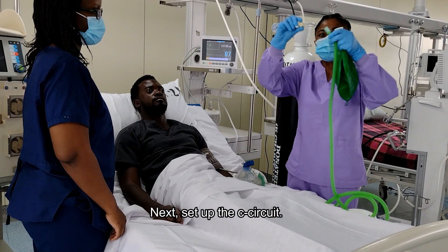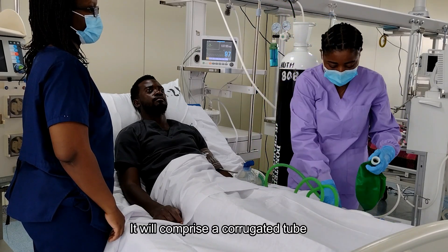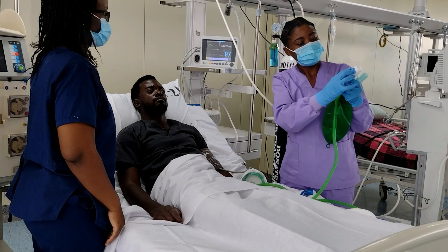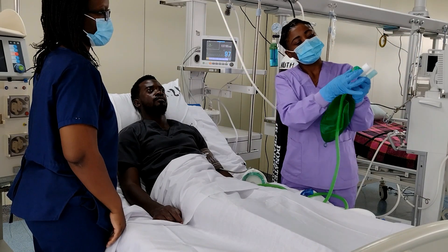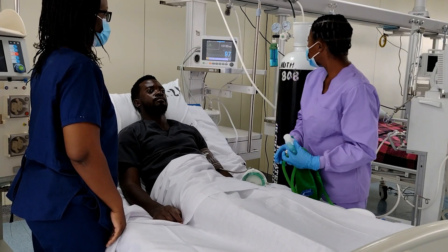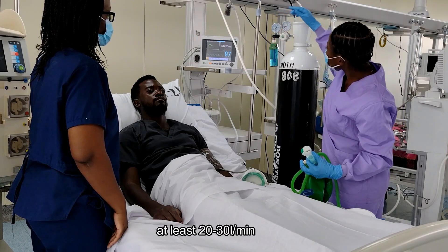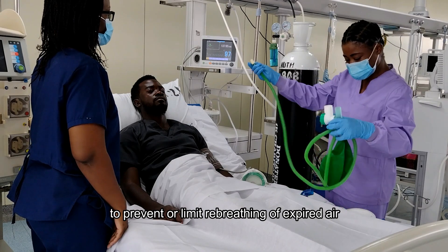Next, set up the C-circuit. It will comprise a corrugated tube, a reservoir bag, and an adjustable pressure limiting valve, also known as an APL. We will also need a high flow rate of oxygen of at least 20 to 30 liters per minute to prevent or limit rebreathing of expired air.